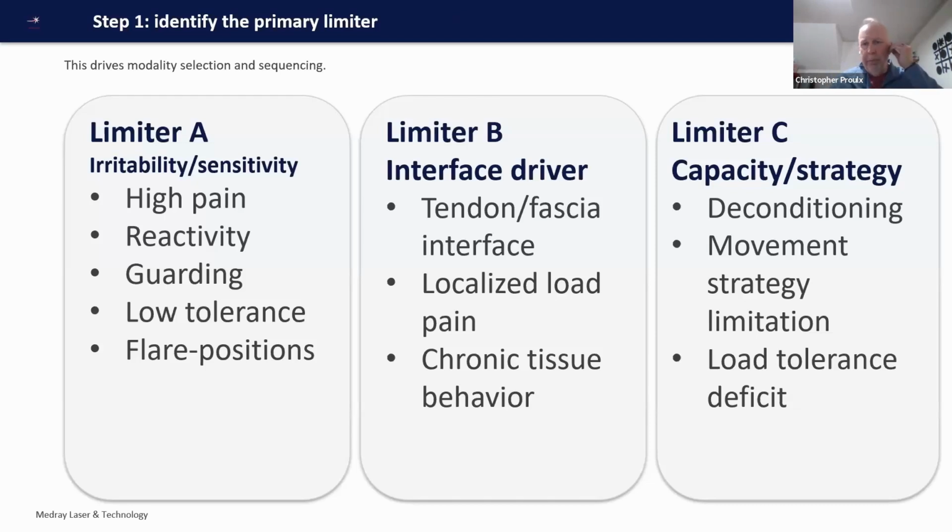So those flare positions can be important. And dealing with one now, they wanted to send this person out for an MRI. And I'm like, well, she has horrible posture. She does not experience any pain during her recumbent positions or lying down. It's really only going to be when she's actually moving. So think about those and maybe what does that mean? Well, I can't really ask you the question, but what does it mean? Again, I probably want to use something that's going to be non-contact.